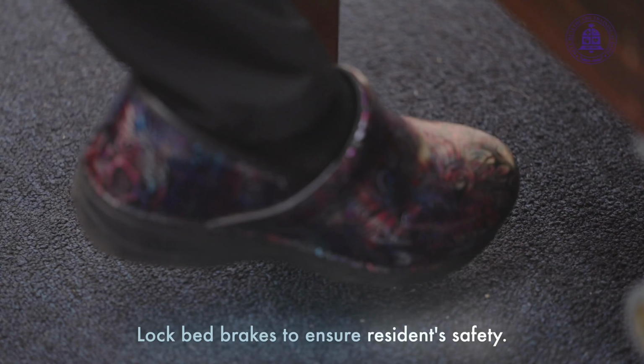Perform hand hygiene. Cover all surfaces of hands with hand sanitizer. Rub hands together until hands are completely dry. Explain the procedure to the resident. Provide for resident's privacy. Obtain a gait belt for the resident.